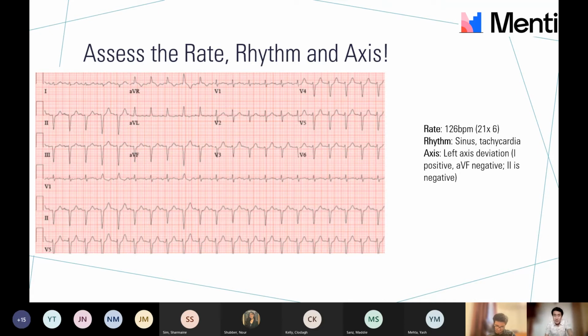Here we go. If you get axis, you can get the rest of ECGs. This is the most challenging bit of an ECG, figuring out how an axis works. I didn't know this for like 2 terms. Okay. I'll give you a 10-second countdown now, and then we'll get going. 5 of you responded. Let's see if we can get a few more from you.